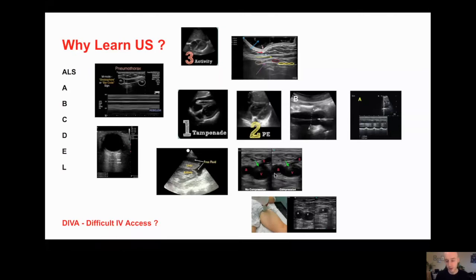Looking at DVTs, sending a patient down to ultrasound for a query DVT. It's quite easy to look at a clot on ultrasound. It looks like echogenic tissue that you can't compress. It is very important to point out that even though you're learning these skills, it is rule in rather than rule out until you're competent and signed off.